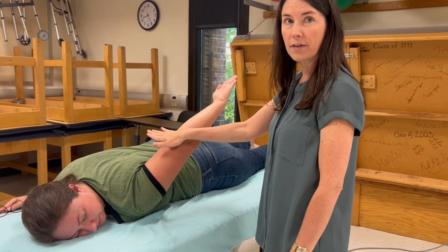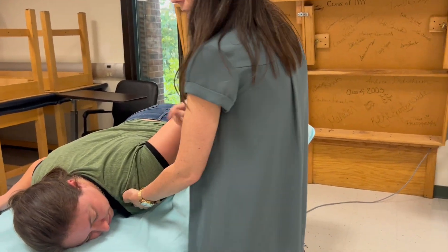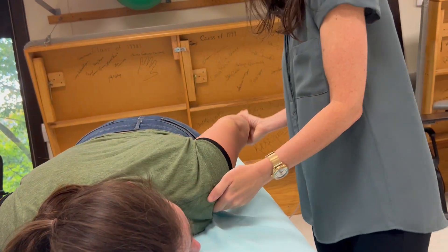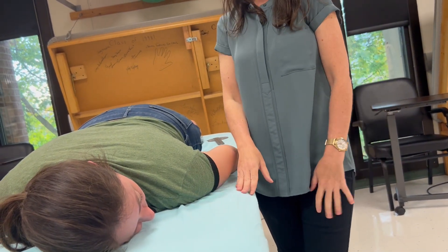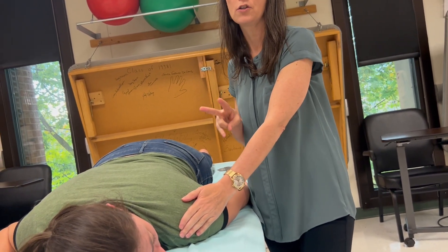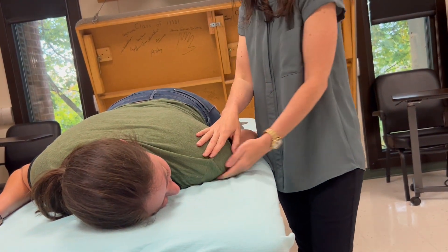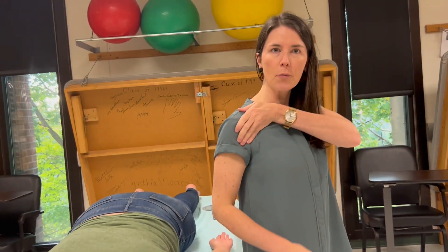Resistance is proximal to the elbow. For stabilization, if the head of her humerus comes off the bed, I'll cup under there. Stay strong — good. Some people's humeral head will stay on the bed when they extend, so you can let the bed stabilize, but still put your hand there to get into the habit of always using two hands for MMT, or slip your hand under for additional stabilization. Be careful to stay on the anterior humerus and make sure your hands aren't accidentally grabbing soft tissue — you really need to be cognizant of where your hands are.